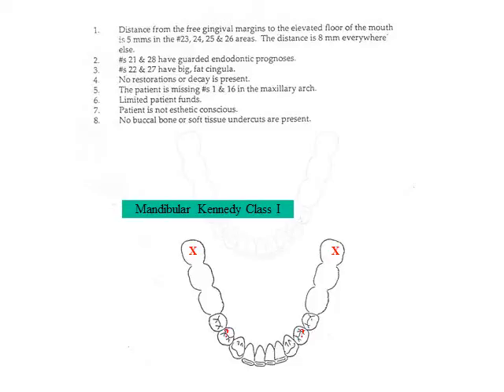Frequently mandibular premolars are the weakest abutments. One should take this into account when designing the RPD. As always, it is a good idea to refer to the patient's existing partial, if there is one. Various other factors from the clinical examination are listed.